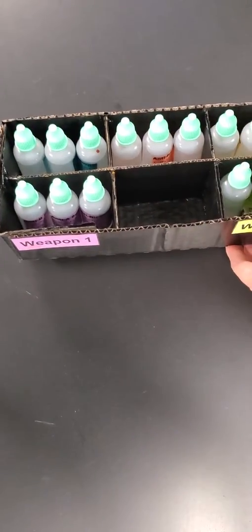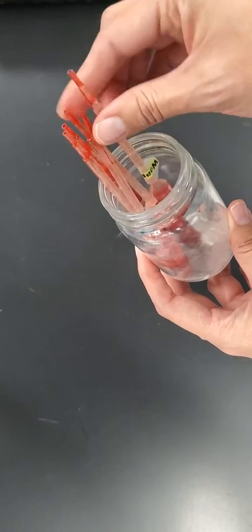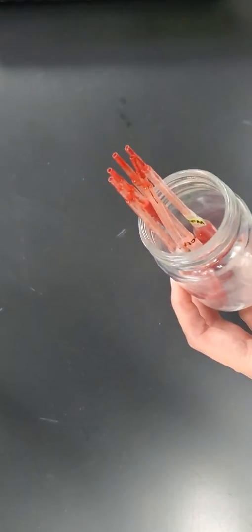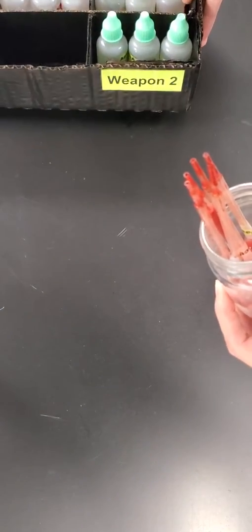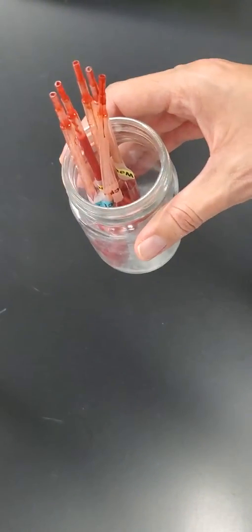And if you notice, again, you have the serums for each of the suspects and then the serums for each of the weapons. Now, in terms of the testing, the blood is going to be found in these pipettes, and it's also going to be color labeled. If you notice, this one's weapon 2, which matches the color in your box for weapon 2. And you're going to be using these pipettes to test the blood.